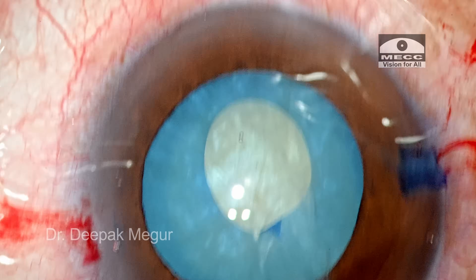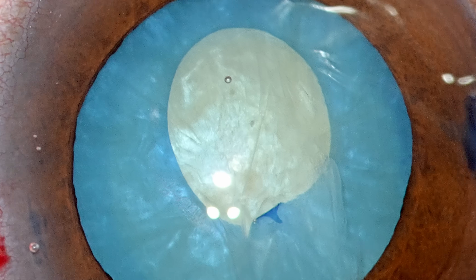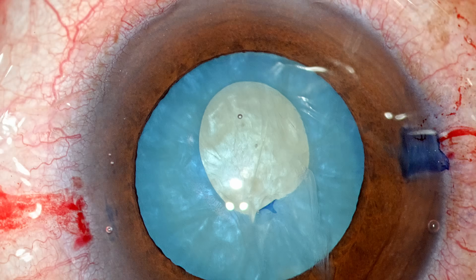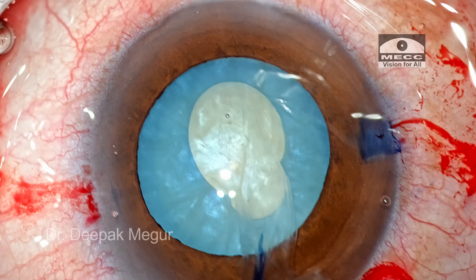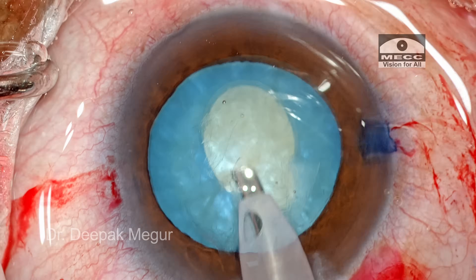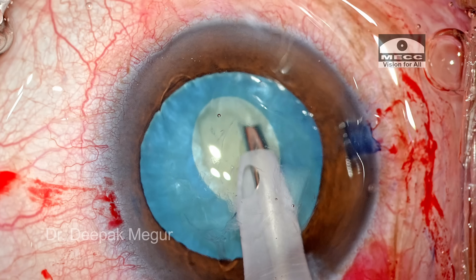That flap is torn and we have a sort of rhexis which is not complete — there is a small V-shaped tear still present, so I can't proceed with the surgery as yet. I need to take care of this part. We now have an irregular eccentric-shaped rhexis, but it is good enough. I need to decompress the capsular bag before attempting a second rhexis.